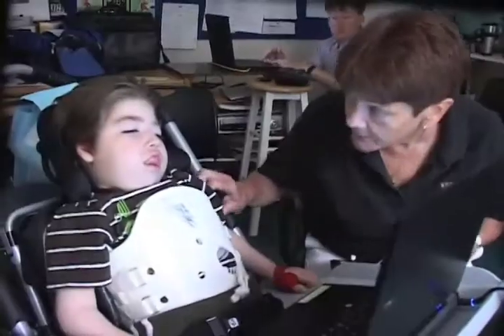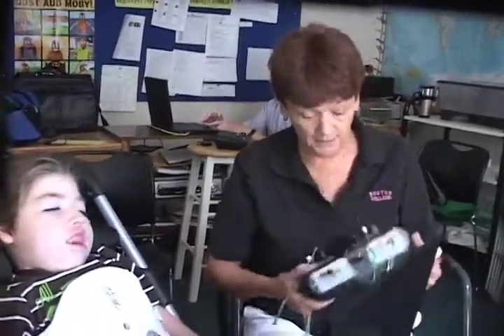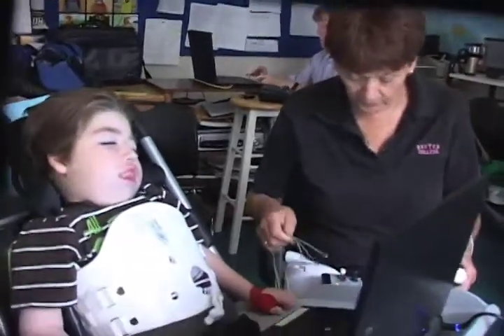This is William, and William's going to demonstrate for us how we actually hook up and use the Eagleize electrode system. It's very imperative that you put the electrodes on the person that's going to be using it in the proper order.